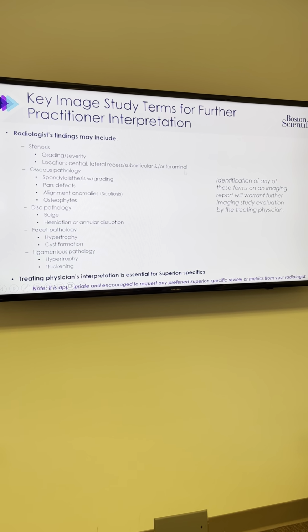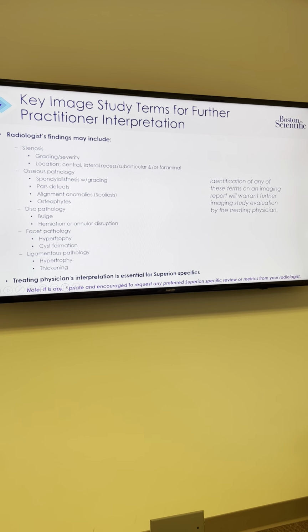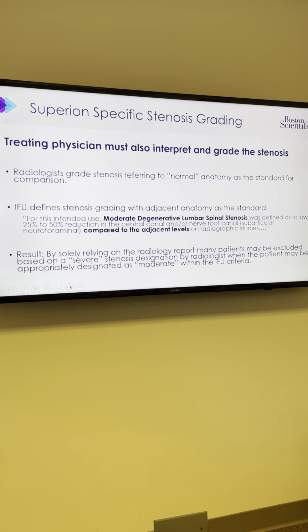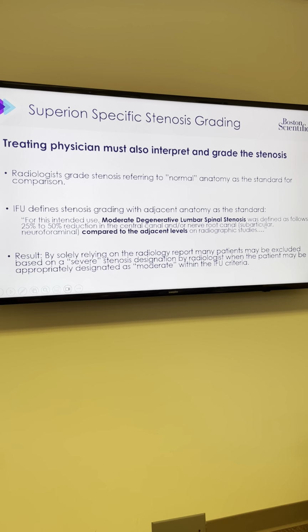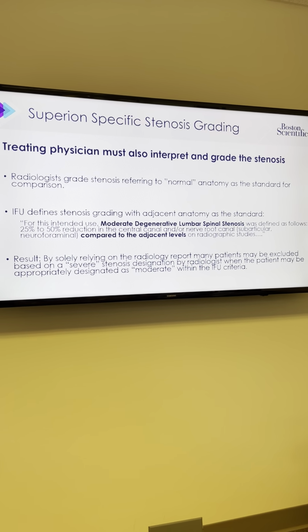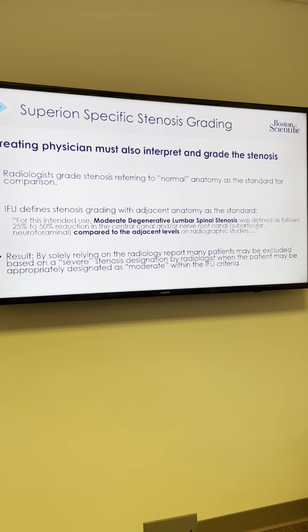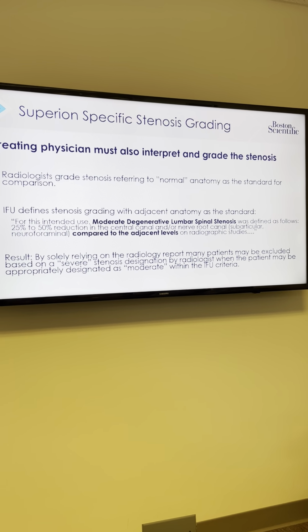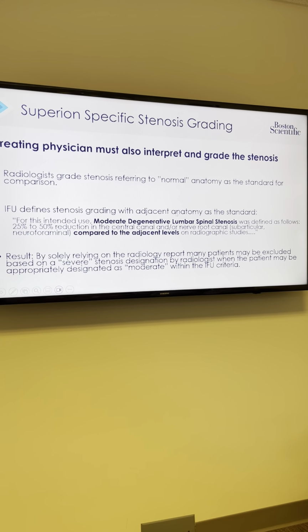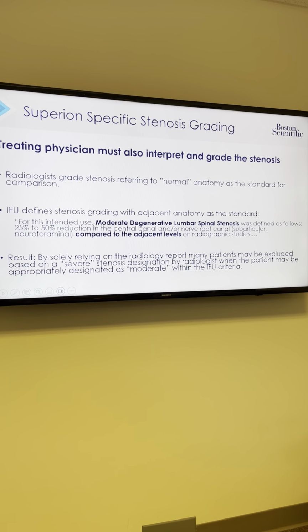Now, I guess this is talking about radiologists going to look through all these things, and they're supposed to assess all these different things, not that they always do. But the most important thing here is you must also be able to interpret and grade things, because you are the one doing the procedure. And I can assure you that if something happens and you say, well, I just looked at the report, you will write a check. So my point being is you're the one working on the patient. They're your patient. You need to know what you're approaching.